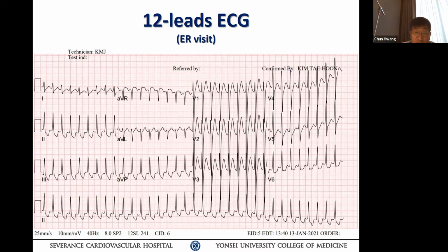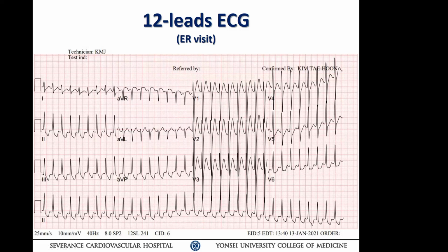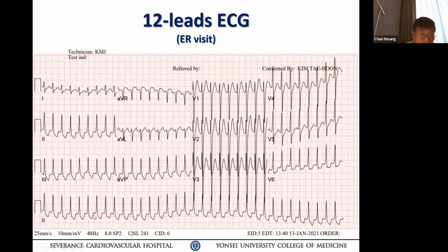근데 이 타키카르디아 보면 닥터 봐. D3 now, what you see? You don't see any more P wave. Like what we see. Lead 2, I can see retrograde P wave very small, but lead 3, I cannot see it. Lead 2, you have a definite retrograde P wave. 봤어, fellow? 네. The P wave is pointed, arrow. Lead 3, 2, bottom tracing. 맨 bottom, 내려와. 쭉 계속되는 거. Yeah, 거기. No, you just passed. 더 거기 보지 그거야. 바로 그거. Right there. That slight notching. Okay?